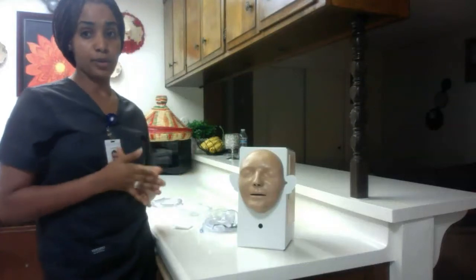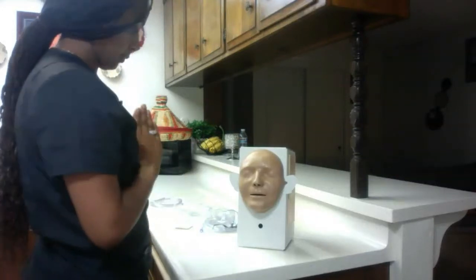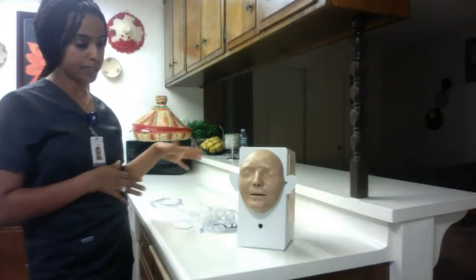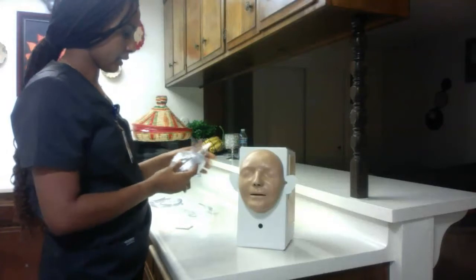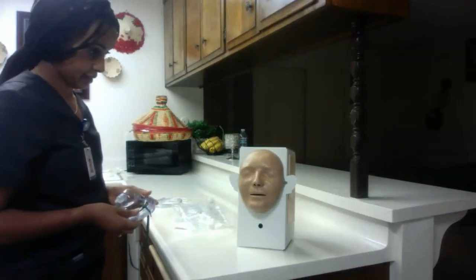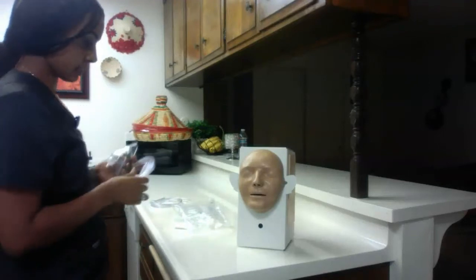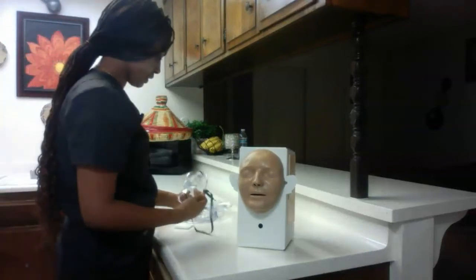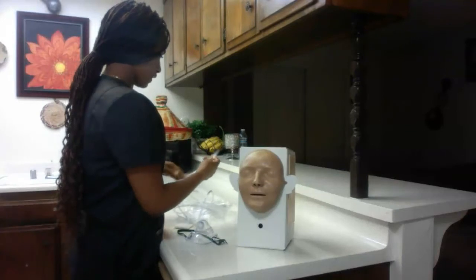Your doctor ordered the mask because we cannot go over 5 liters using the nasal cannula. With the mask we can go up to 10 liters. So you need more oxygen — we want to keep your oxygen saturation above 90%. We do not want it to go below 90%, so we're going to use the mask to help you breathe and get enough oxygen.